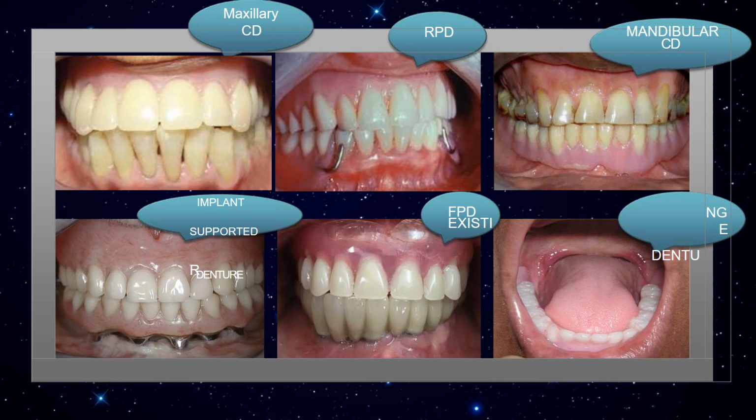usually the scenario in which we can see this is when a single complete denture is opposing a natural dentition, or a removable partial denture, or an existing implant hybrid prosthesis, or a fixed FP1 type of implant prosthesis in which there is no gum porcelain, or in the case of immediate implant overdentures or implant fixed restorations.